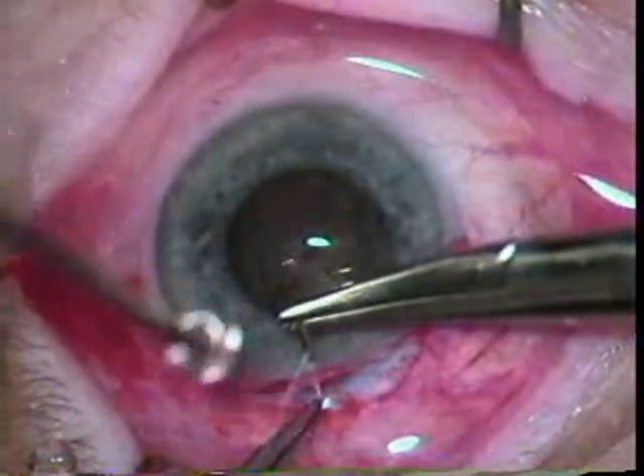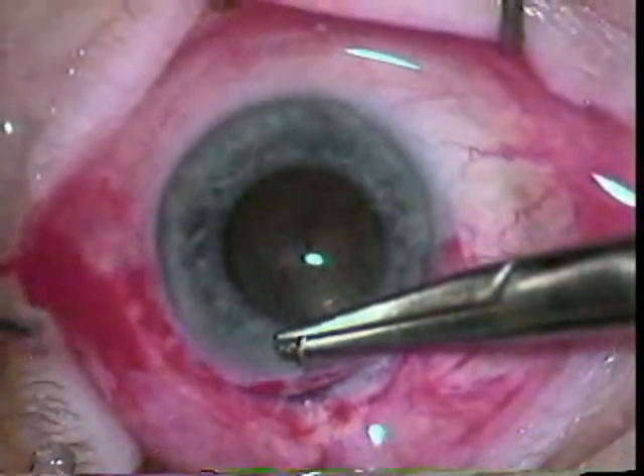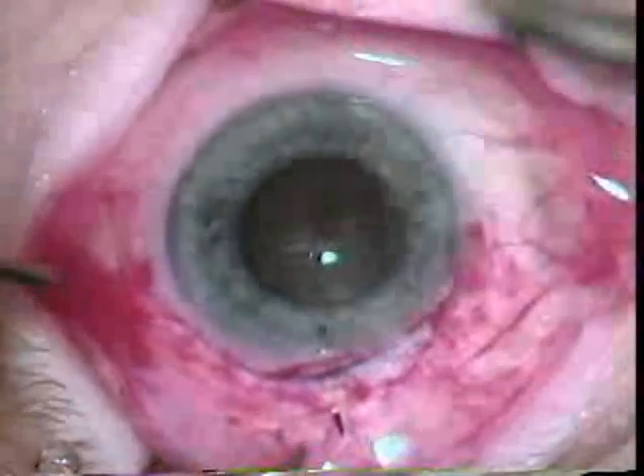A safety suture is placed using 7-0 Vicryl. This safety suture would allow you to quickly close the eye should you have a choroidal hemorrhage.